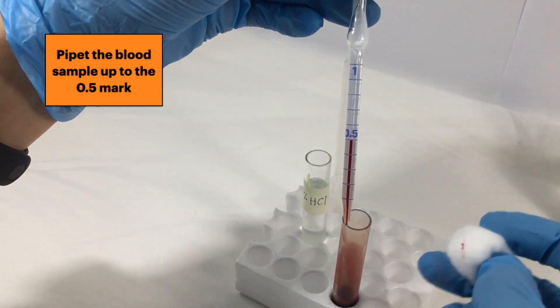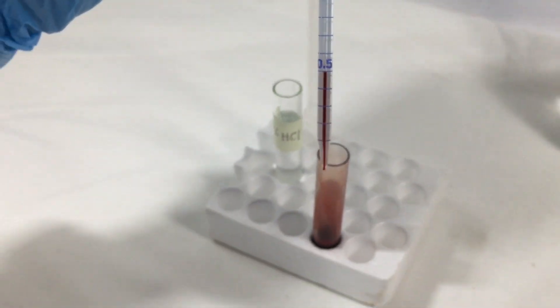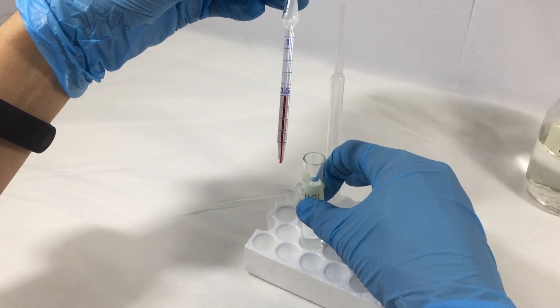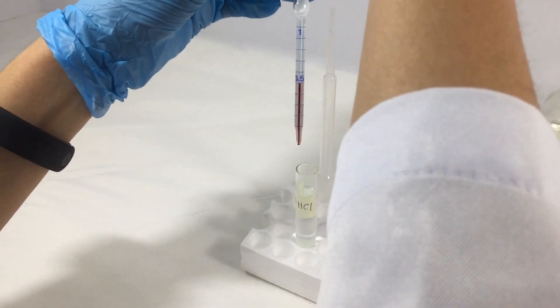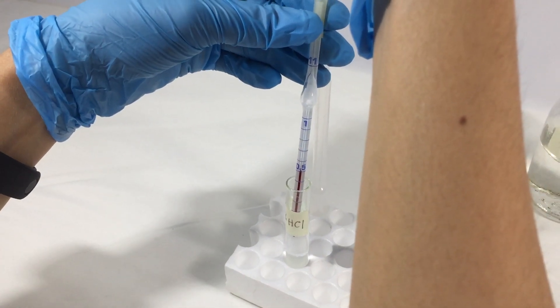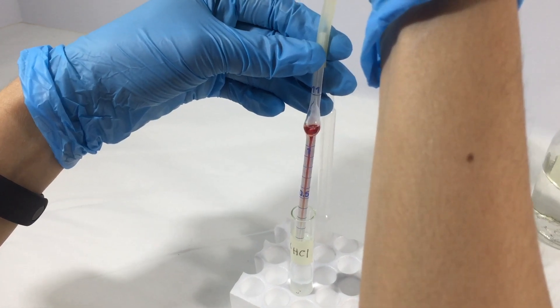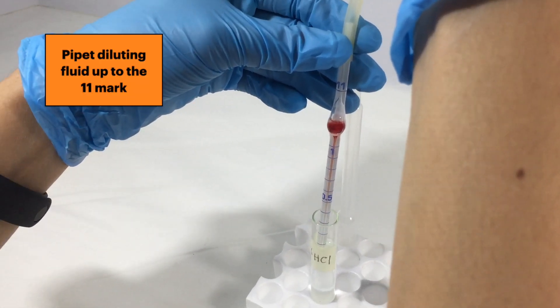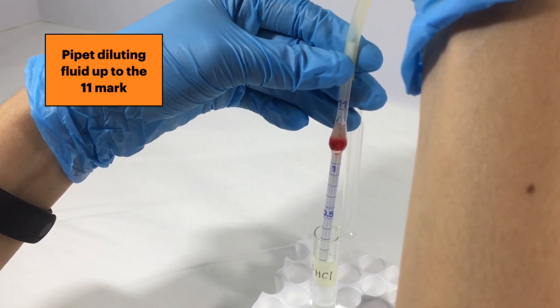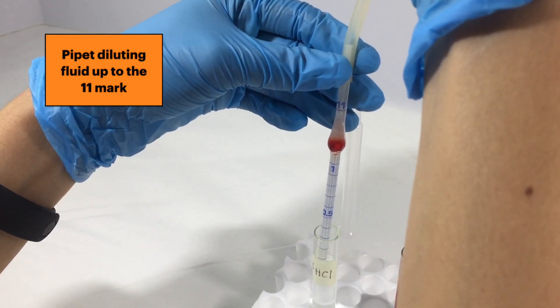Wipe excess blood using a cotton ball or some gauze. Now, take your WBC pipette and place it in the tube with the diluting fluid. Immediately pull the plunger of your syringe to collect the diluting fluid in the pipette's bulb. Keep doing this until you reach the 11 mark of your pipette. Make sure that you do not go past the 11 mark, otherwise you will have to repeat the process.